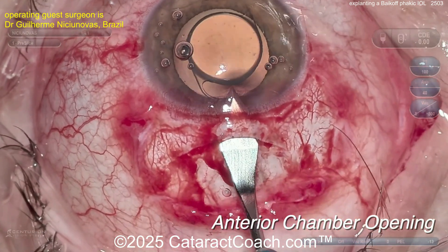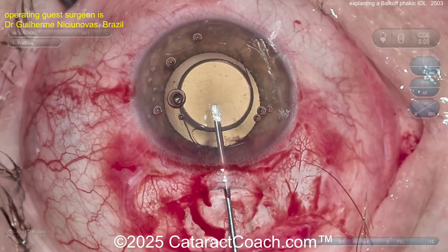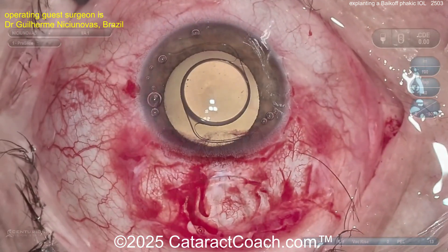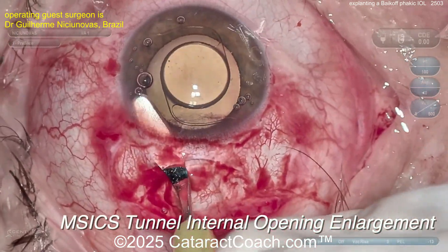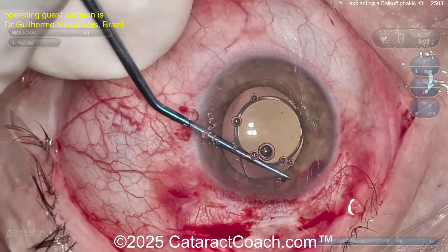Nice and easy. You can widen up the incision — look how long that tunnel length is; it's definitely going to seal very well. Viscoelastic can help you elevate that lens and get it out of the eye. Opening the MSICS tunnel to its wide points, and then you can just grab this IOL with forceps and remove it.